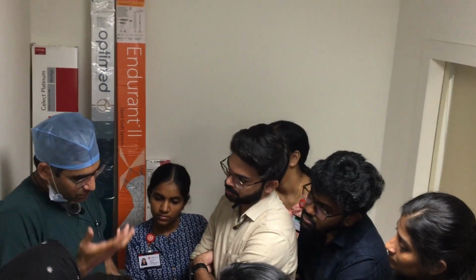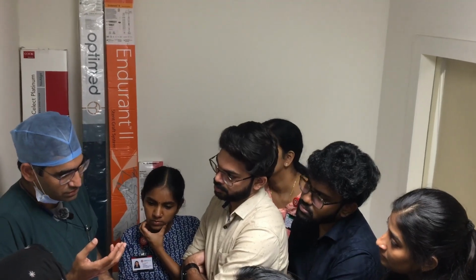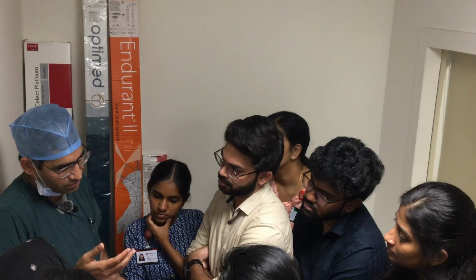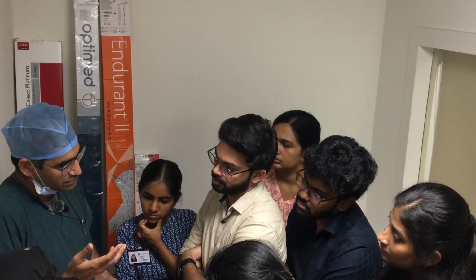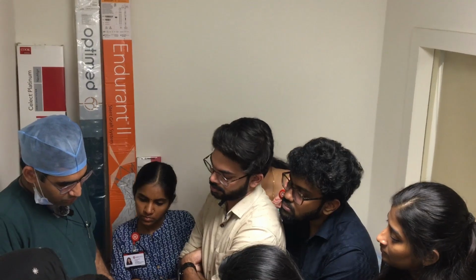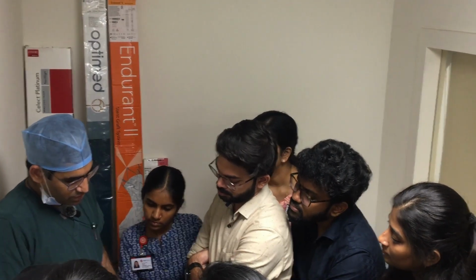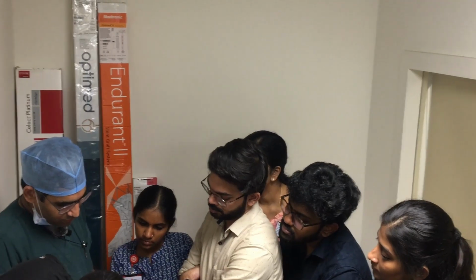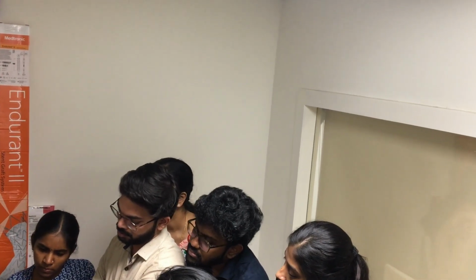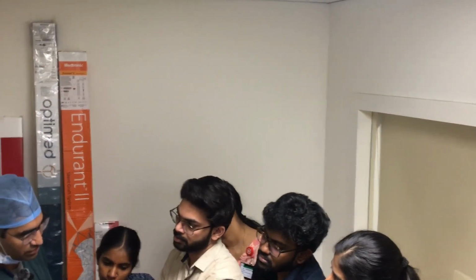So what is angioplasty? It is a controlled dissection. If there is a plaque, we control the rupture of the plaque and make the space. We basically plaster the plaque to the wall and make the space. From an exam point of view, the markings, what these markings are, will be asked. One thing you should know is the sheath size compatible with the balloon. If it is 7 French, you have to take a sheath larger than that up front.